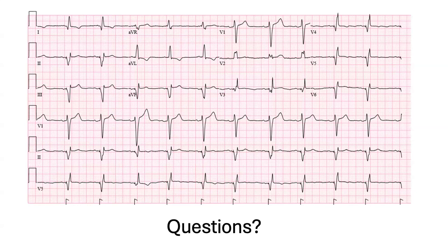So for that other hospital that is doing it as their goal, they're probably doing it as part of a registry and trying to see what happens, but it is not yet standard of practice. Standard of practice is still CRT. And if you don't have any viable options, then you can do conduction system pacing. They've even made a caveat that if you are putting in a dual chamber pacer, and you don't even know what the patient is going to do, it's a reasonable option to go straight for conduction system pacing.